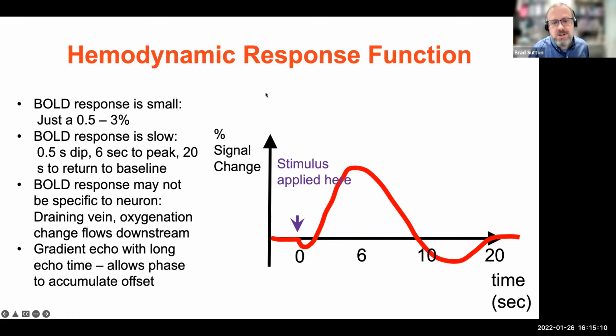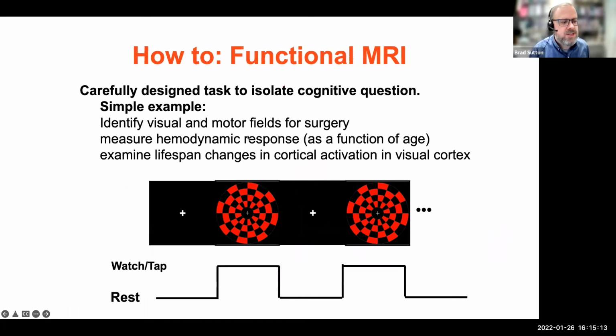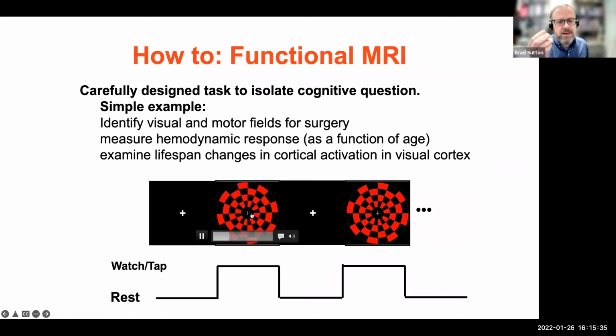All right, and certainly if people have questions, I encourage you to ask. So I'm gonna show you an example of an fMRI task, okay? And this is going to be just to identify visual or motor areas. We may instruct the subject, watch this fixation cross. Okay, so this is time going in this direction. Watch a fixation cross for a while, maybe 20 seconds or so. We're gonna turn on a flashing checkerboard. Okay, and we're going to stimulate their visual cortex. They're supposed to keep looking at the plus sign, and maybe they're supposed to tap their fingers while they're looking at the plus sign. I'm just going to show you visual results here. So just watching the plus sign, and then it goes to fixation cross, and then it comes back again. And like I said, maybe 20 seconds off, 20 seconds flashing, 20 seconds off, 20 seconds flashing, and we repeat that a couple of times.